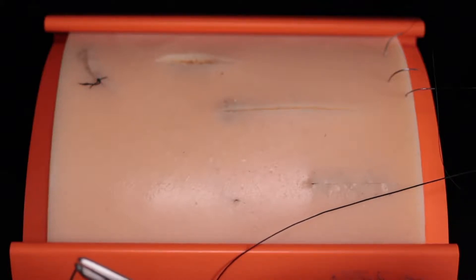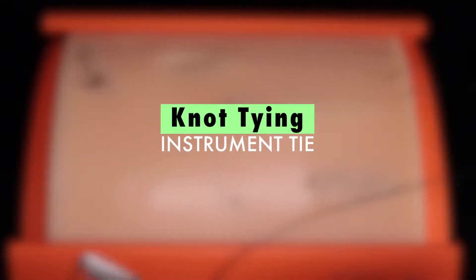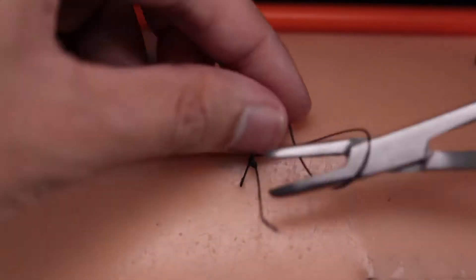Hi, my name is Don. I'm a general surgery resident and this is a simple tutorial on the instrument tie. This is the first video in a series about knot tying.